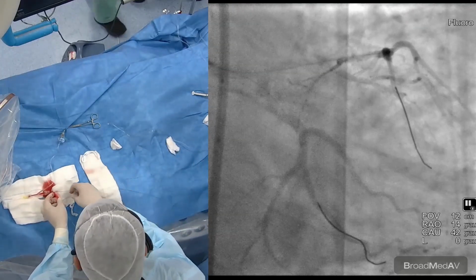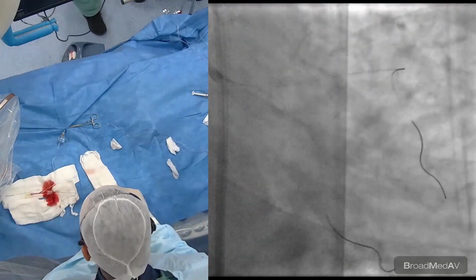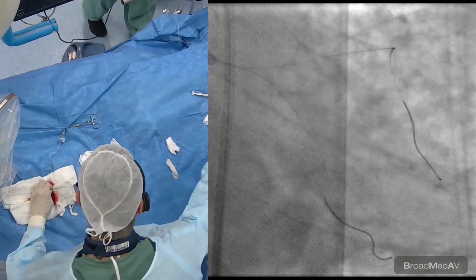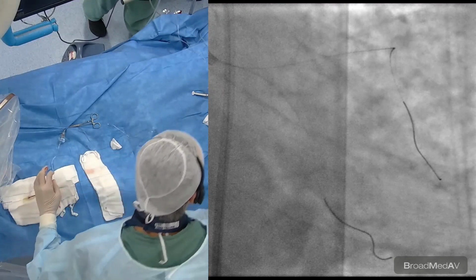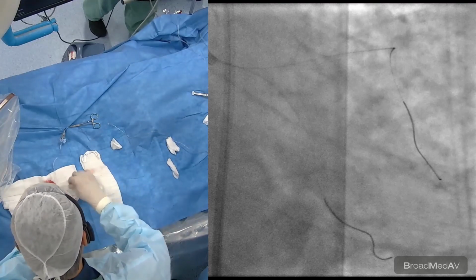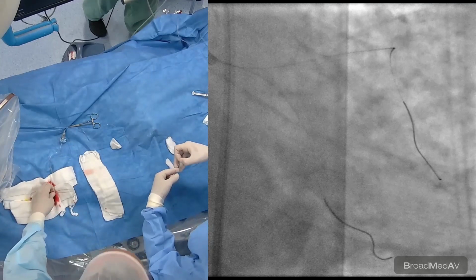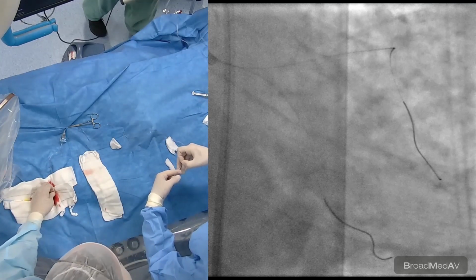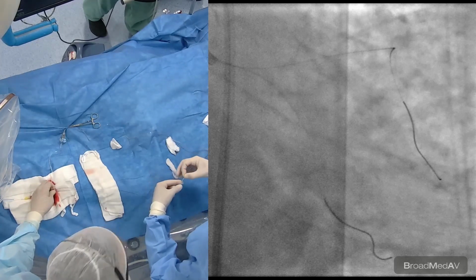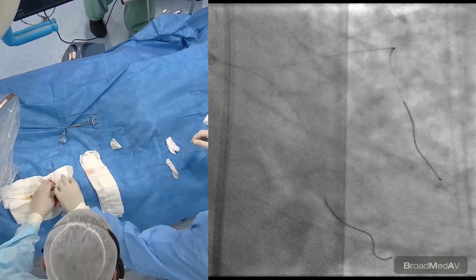So it doesn't matter how long you inflate, just 10 or 15 seconds. Exactly. Especially because you never know how much ischemia the patient can tolerate in the left main. So we're going to go with the IVUS now to the LAD. I think you should decrease the ischemia as much as you can during this procedure. It needs to be pretty fast because you cannot have an accumulation of ischemia during the procedure. Exactly. That's very important. The patient can become unstable.